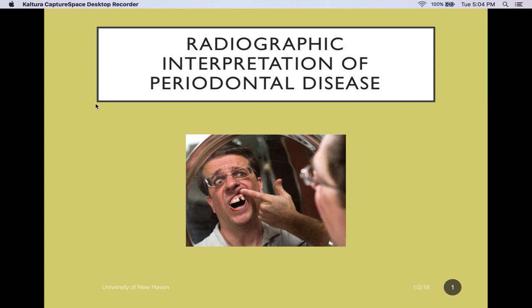When you're evaluating bone, the panoramic film is completely not recommended, mostly because there's very little diagnostic value to see anything for periodontal disease. That's because you can't see any of the specifics. In periodontal disease, you need to see very specific fine changes in the bone.